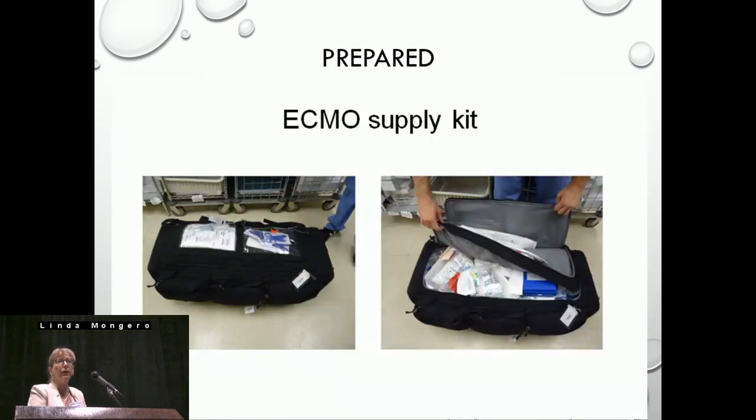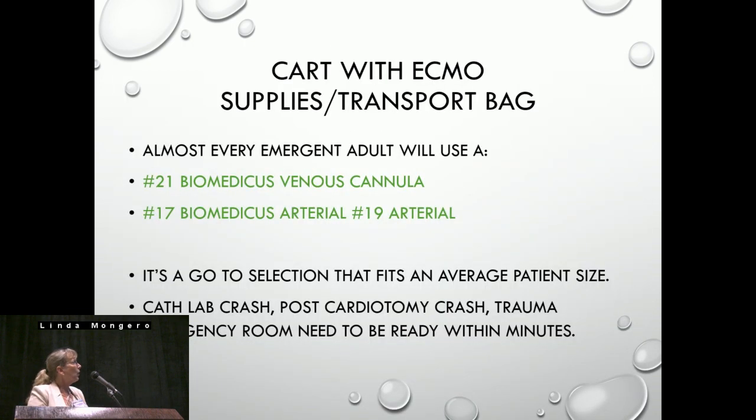Finally, just be prepared. Many institutions have an ECMO cart set up ready to go all the time, and an ECMO supply kit that goes wherever it needs to be when they're called in the hospital. It's a really important ingredient because you don't want to be by the patient's bedside, putting somebody on ECMO and they go, oh my God, I don't have a connector. Let me run downstairs 9 floors to the pump room so I can get what I need. So everything should go with you and be there. A cart with ECMO supplies, again, in the transport bag.